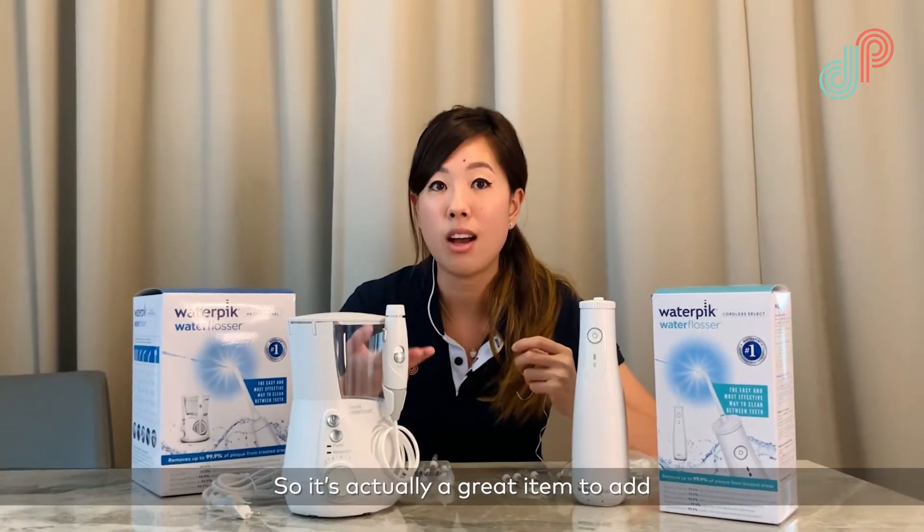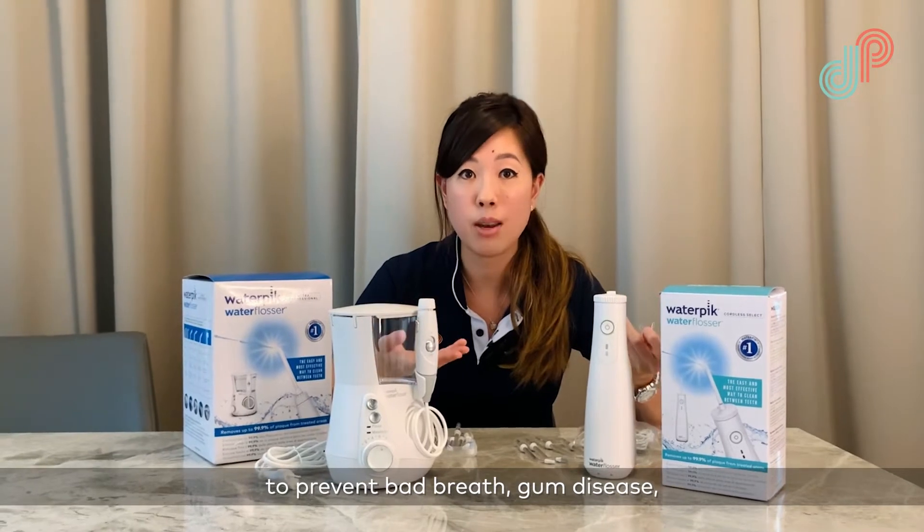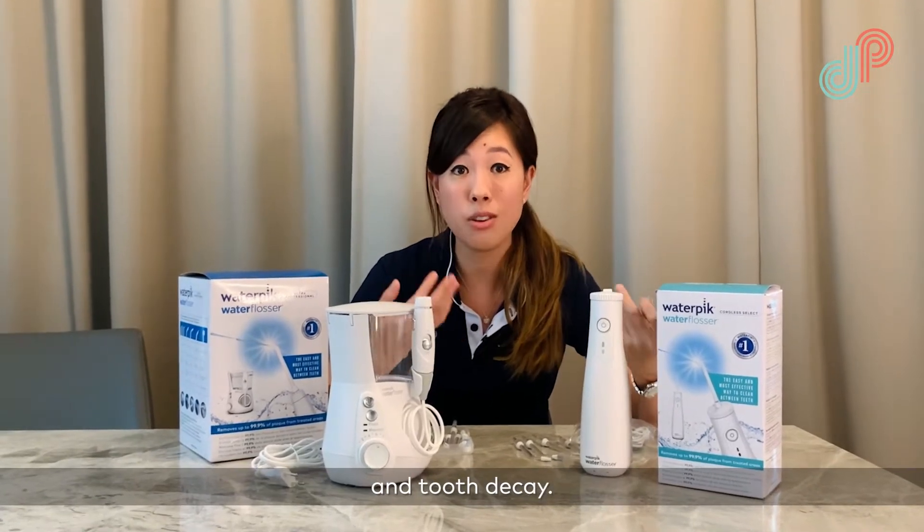It's actually a great item to add to your normal cleaning regime to prevent bad breath, gum disease, and tooth decay.